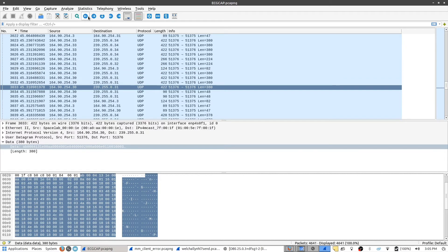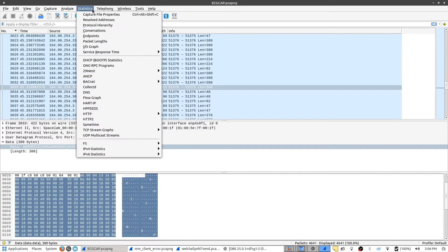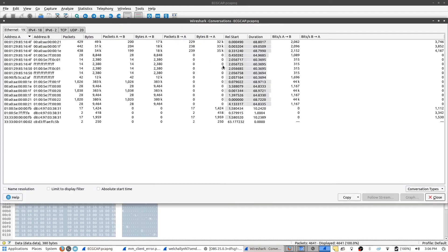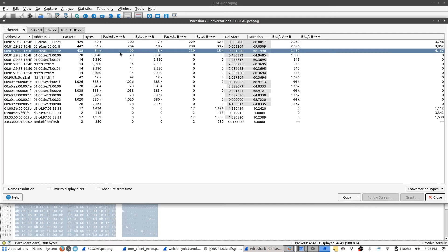There are other things you can do with it. For example, you can look at statistics and IO graph, and you can see the rate of data being sent over the cables at any given time during the capture. You can also look at things like conversations. The way Wireshark works is that in captures it just lays everything out at the time it's received, so it doesn't give you a good idea of where conversations between devices begin and end. With the conversations tool, it will show you the actual sessions between the individual devices.